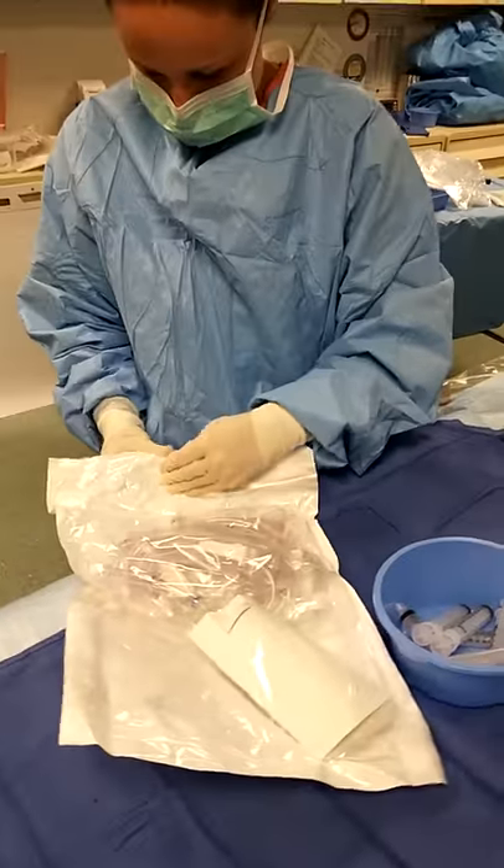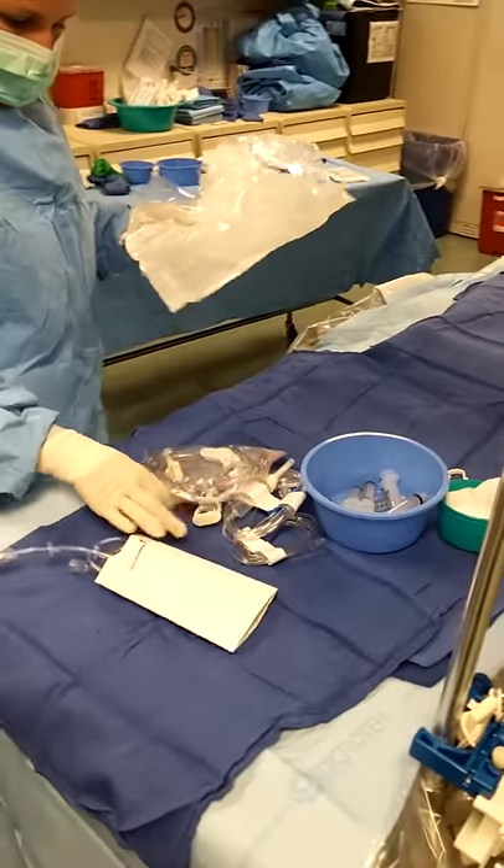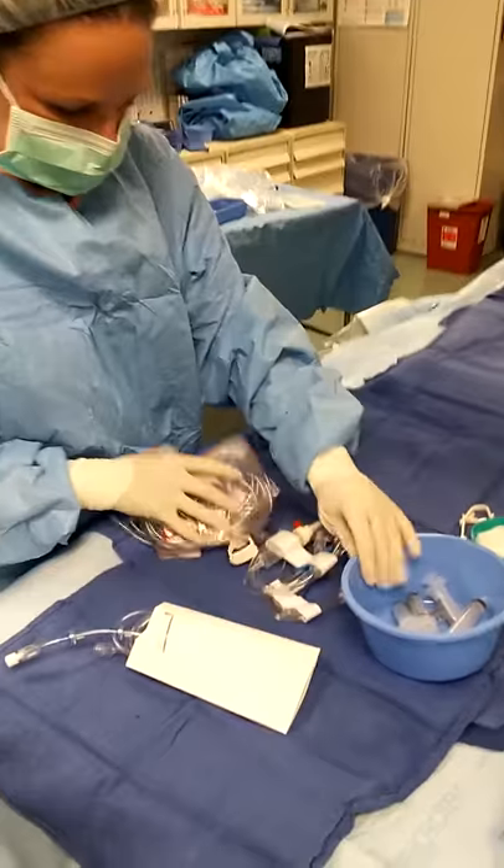You have to open this and dump it out. I recommend you get rid of your bag — it gets in your way.